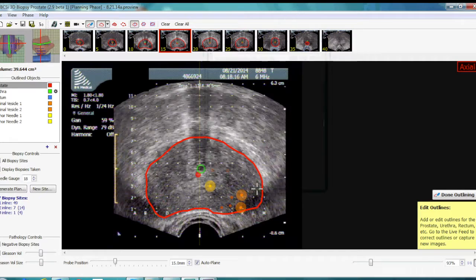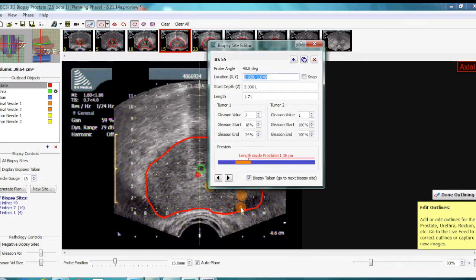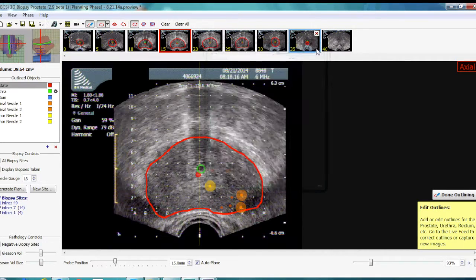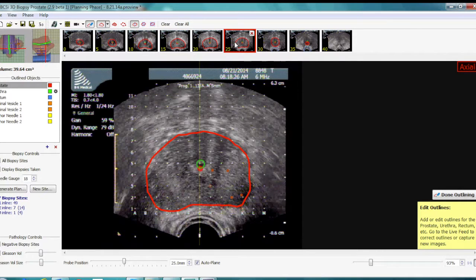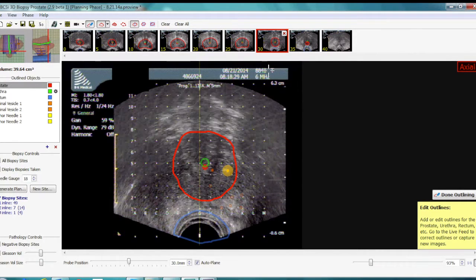This allows the physician to use extremely accurate focused therapy and target the indicated lesions as shown on the dialog box. In this particular patient there are several lesions in the mid portion of the prostate, no lesions further down, and then another set of lesions close to the apex of the prostate.